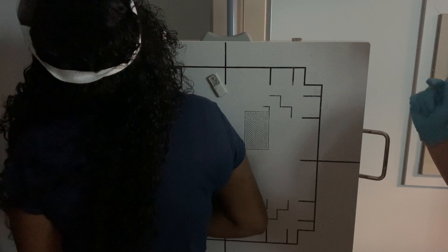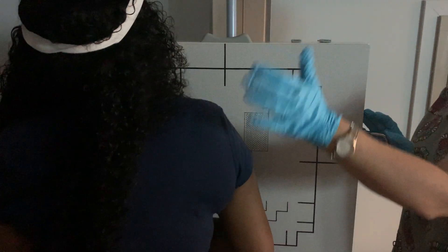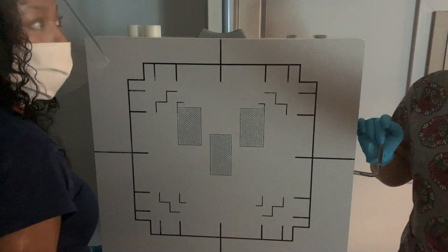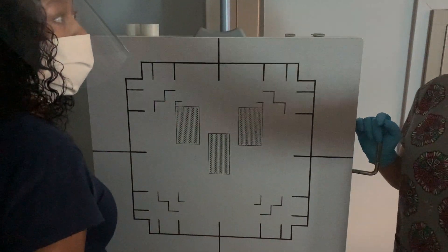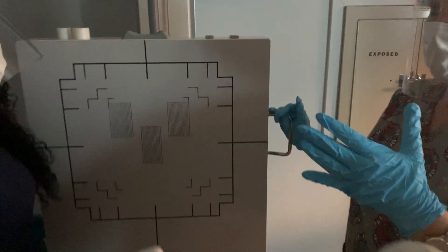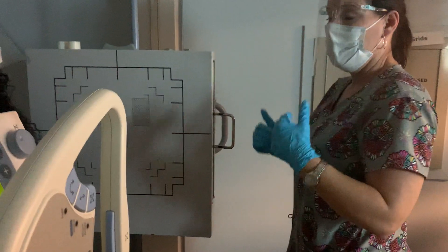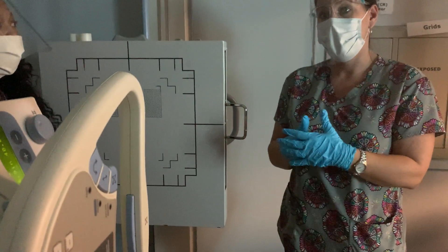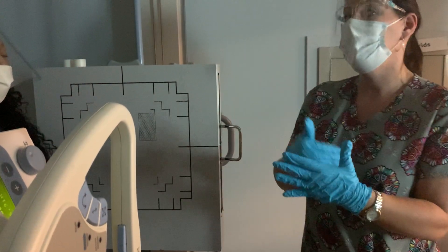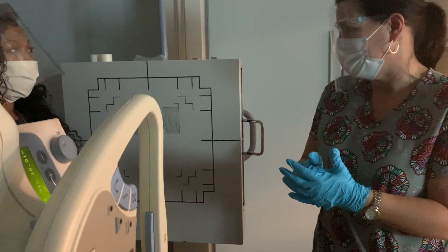So let's stop there and switch — I'll get a different person, and we'll do an AP lateral. No, it is a lateral, y'all, but you're having your patient's body in either a PA or an AP. And so actually we call that either a lateromedial or a mediolateral.